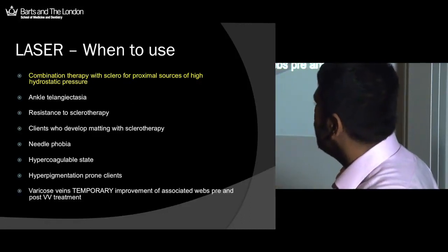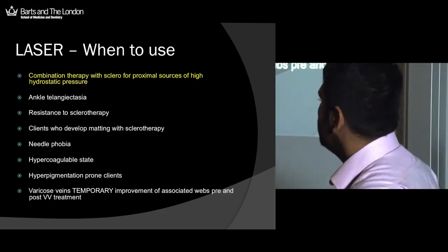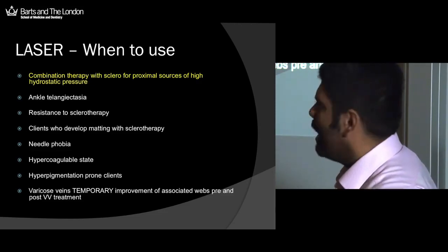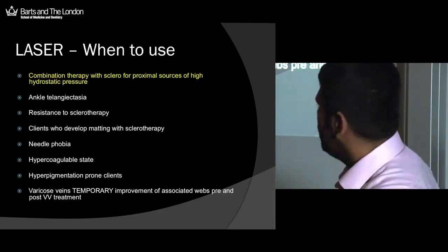People who are needle phobic, obviously. Hypercoagulable state, which is a big contraindication to sclerotherapy. If they have that, I can use my laser quite safely to try and reduce some of their more visible telangiectasia.